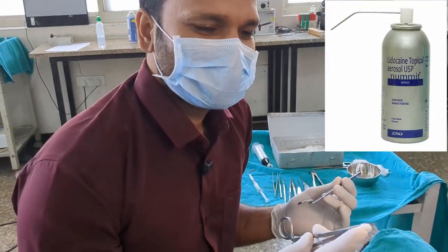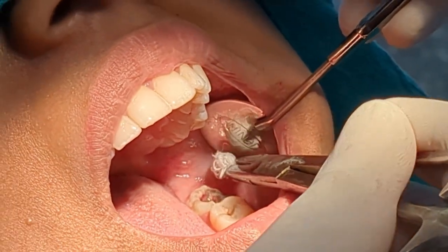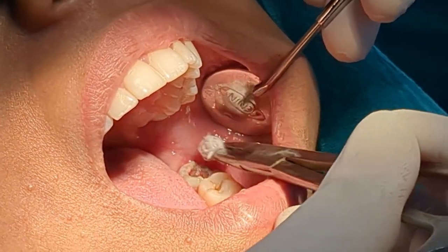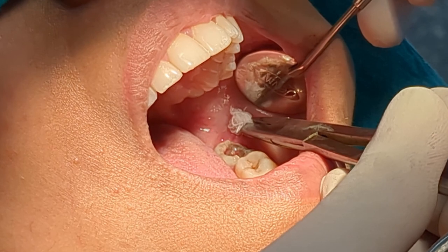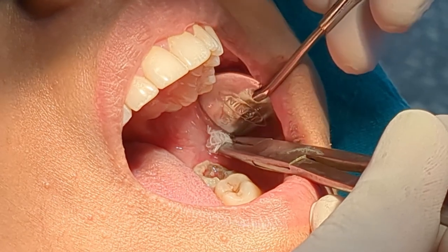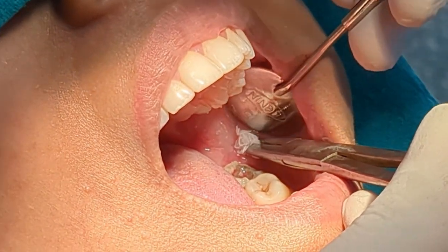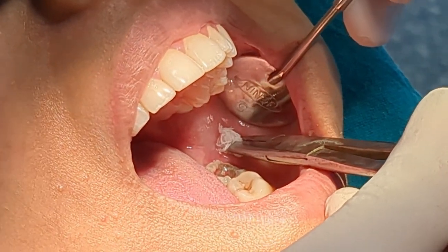This is a topical soaked gauze. I am applying the topical anesthesia at the site of injection for the long buccal. The site of injection for the long buccal is buccal and distal to the last molar — here the last molar is the third molar. I am applying the topical at the buccal and distal to the third molar. We'll wait for the topical to act, and I am also applying pressure to induce pressure anesthesia along with the topical, just to make sure that the patient doesn't feel the needle prick.